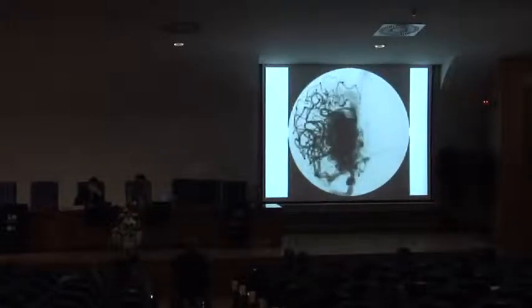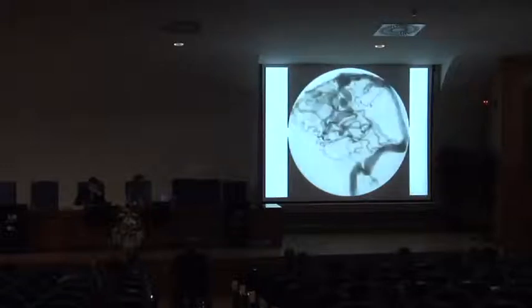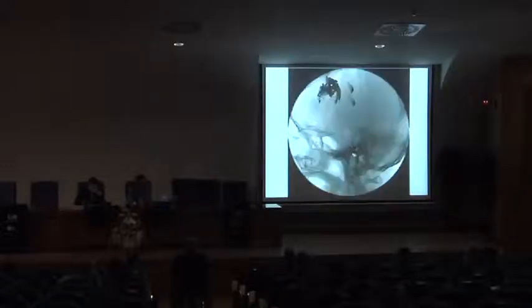And this is not resection of the brain. Complication, you can see this big malformation. So we have a complication after partial occlusion of the AVM, you can see bleeding. We know 3 causes of bleeding. The first is perforation with the guide wire.